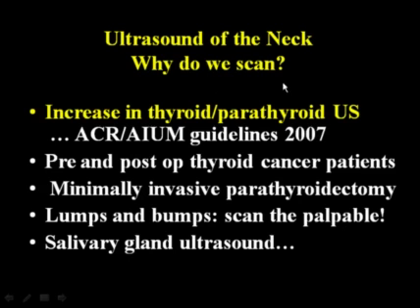First of all, why do we scan the neck? I think most people who've trained in radiology have learned that CT and MRI are far superior in imaging the neck in patients with different head and neck cancers.